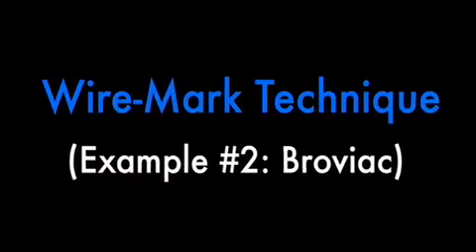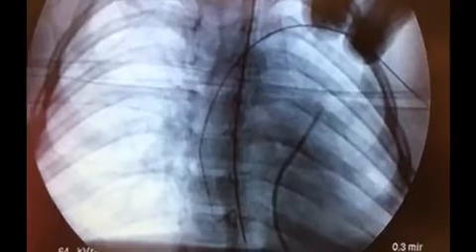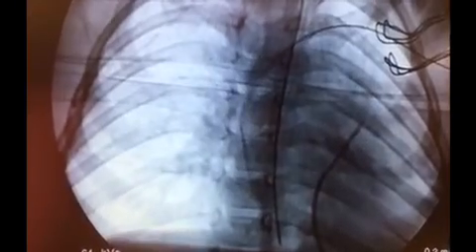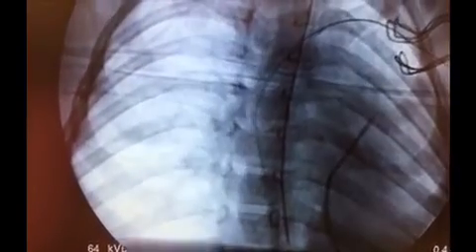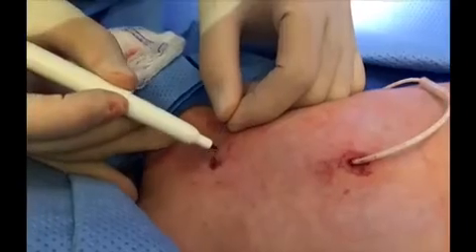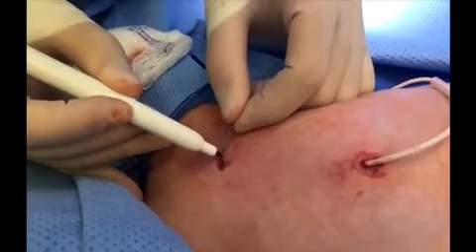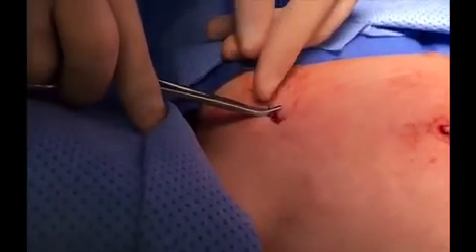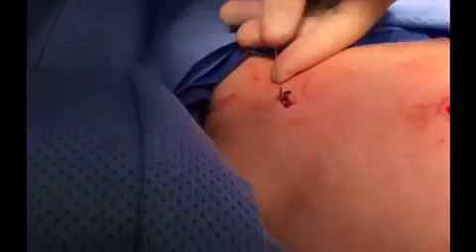Here's another example of the wire mark technique, this time with the Broviac. The wire is placed and then under fluoroscopy, we pull back on the wire until we're happy with the position of the tip of the wire at the atrial-caval junction. We then mark the wire either with a marking pen or with a crimp using a needle driver. Then we pass the dilating sheath over the wire.